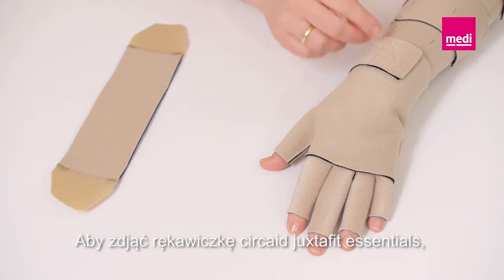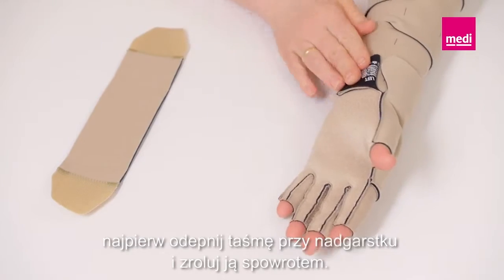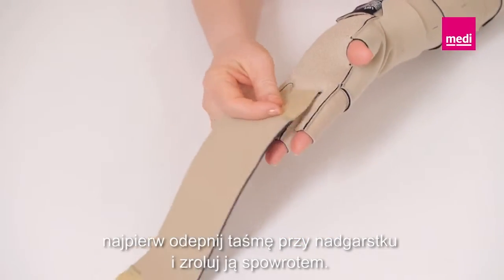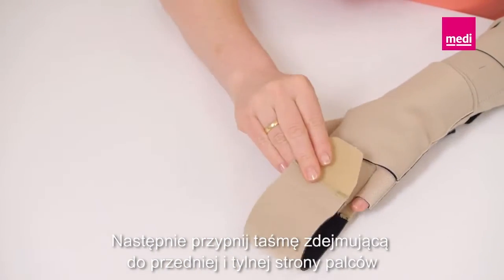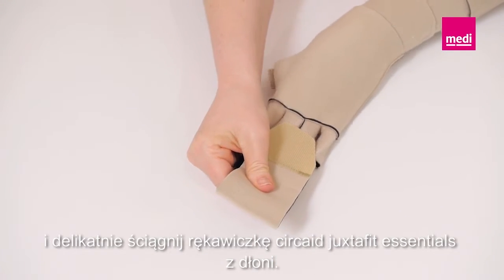To remove the Circade Juxtafit Essentials glove, first detach the wrist band and fold it back onto itself. Then attach the removal band to the front and back of the fingers and gently pull the glove off the hand.